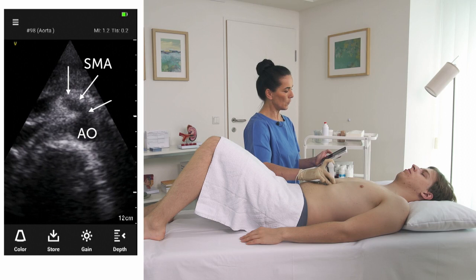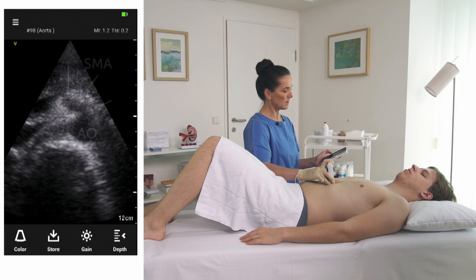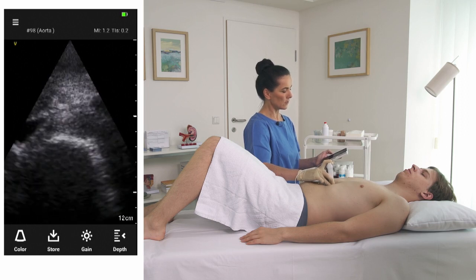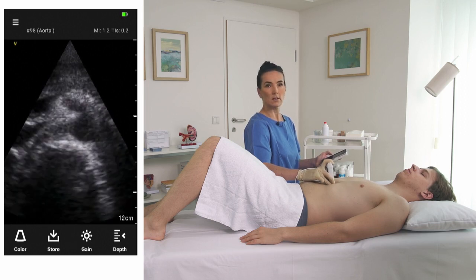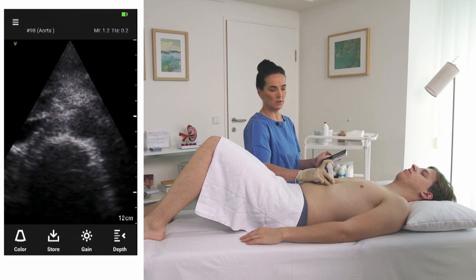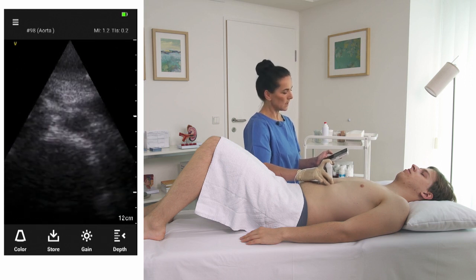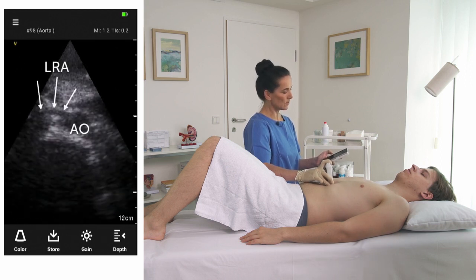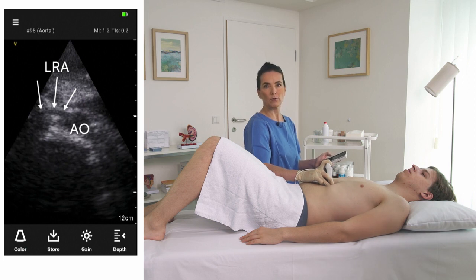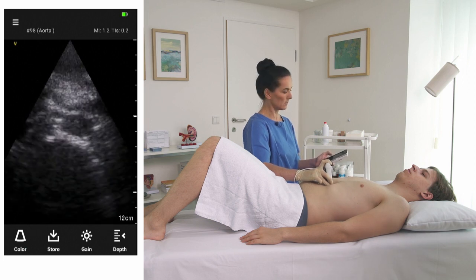Moving even more caudally, while still visualizing all the other structures — the IVC and the lumbar spine — you may see the renal arteries leaving on both sides laterally from the abdominal aorta.